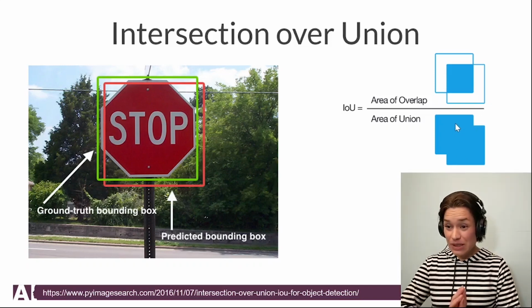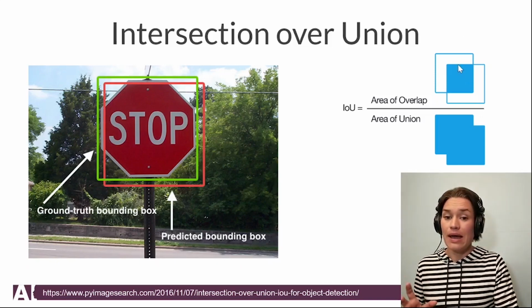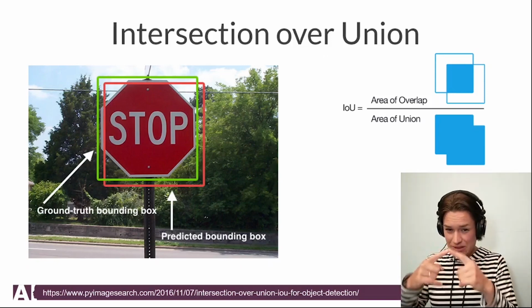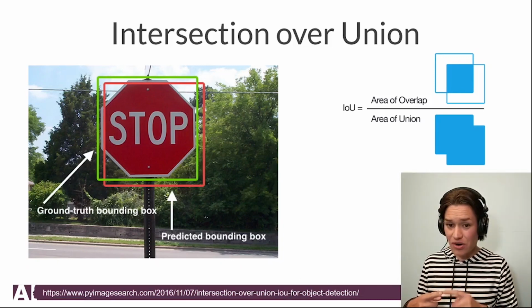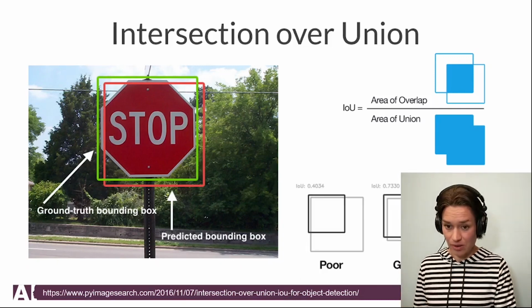So when we use this, we have to ask ourselves, how much of this is still going to be considered correct? If it's just touching with 1 pixel, do we still say it's correct, or is it not enough for us? You will see that in your images, in your markups.